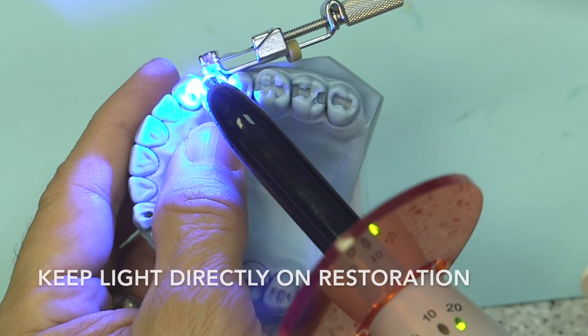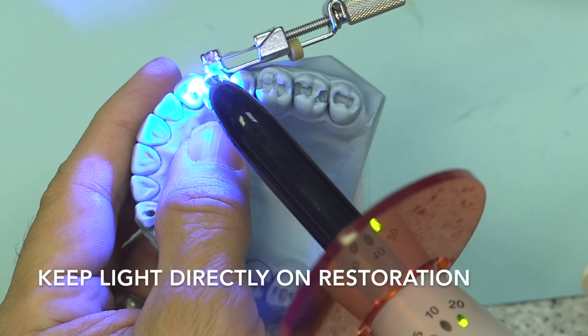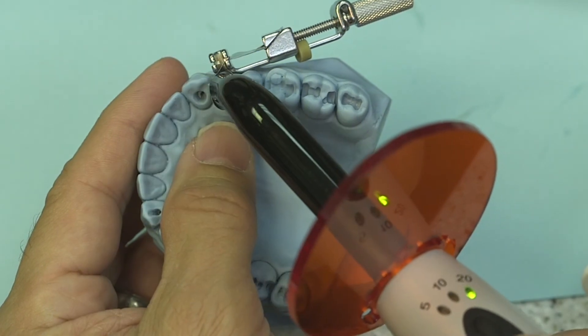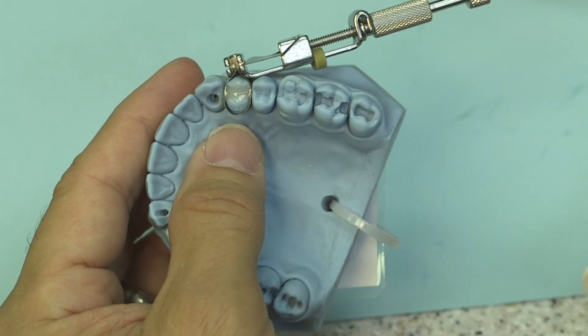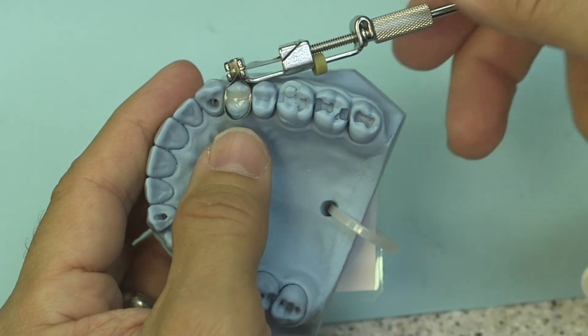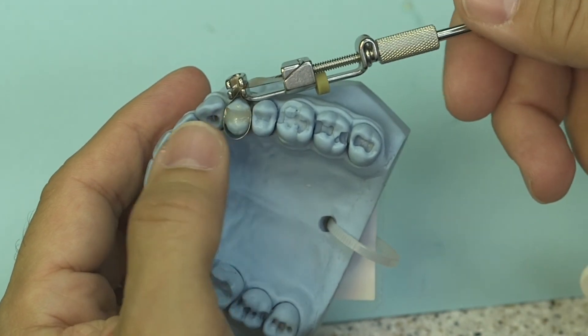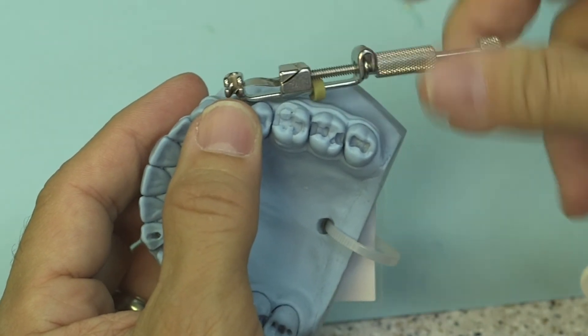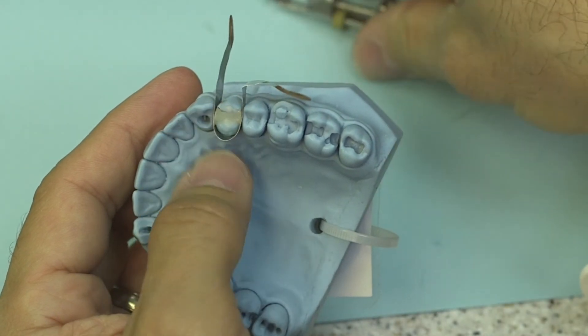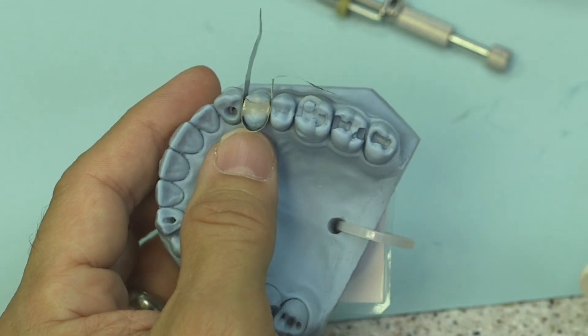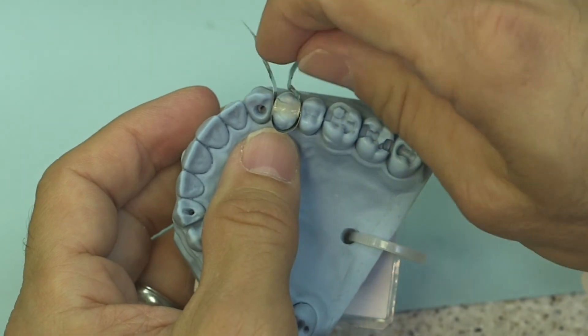Also make sure to keep your light directly on the restoration and if you can possibly watch where your light is aimed, that's another component that's been a big problem. Some studies have shown by Richard Price at Dalhousie University that if you do not aim the light properly you're not going to get a good cure, so it's important for you to consider that.